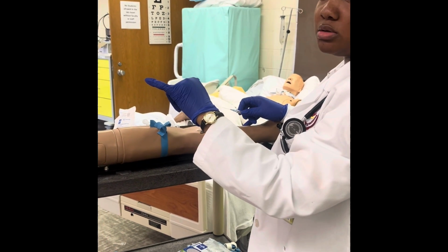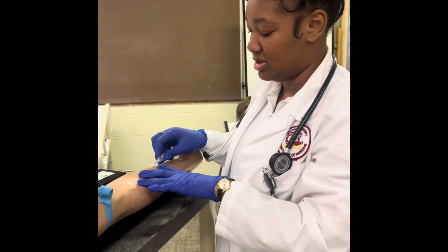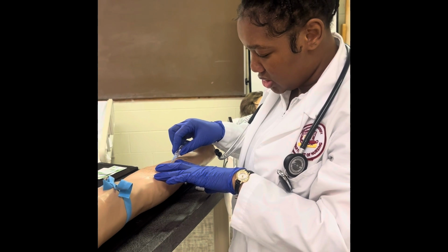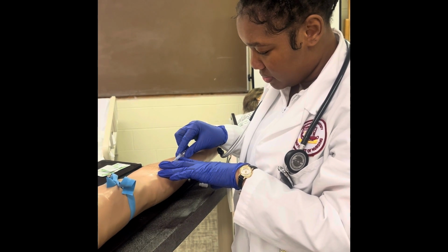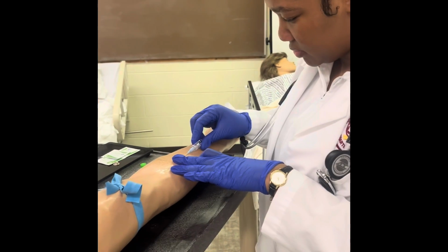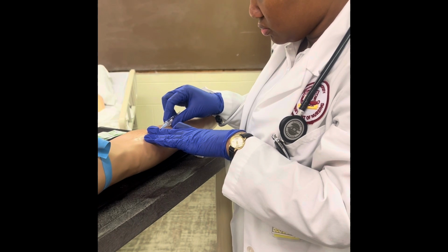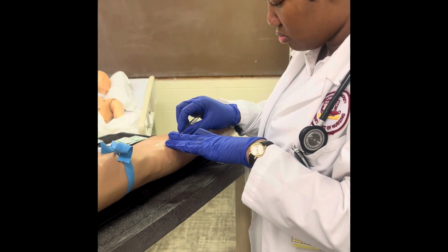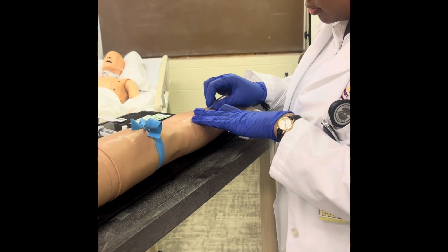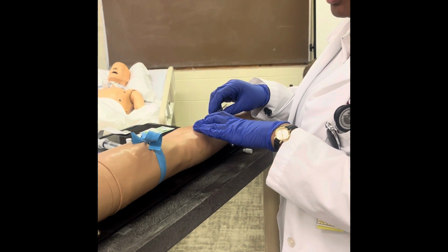Control the blood. You know how to do that? I think it's unclamped, so clamp it when I say I see blood return. All right, I'm going to insert, bevel up. Keep going until I get blood return. Okay, I'm getting blood return slowly. You can clamp it. Thank you.